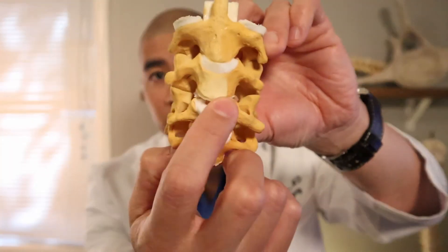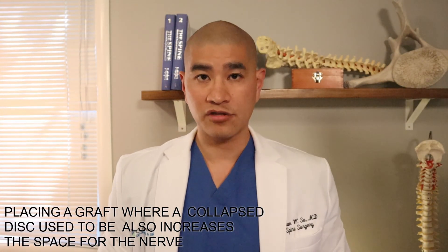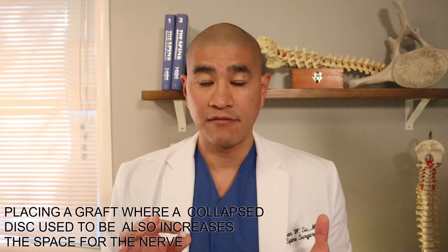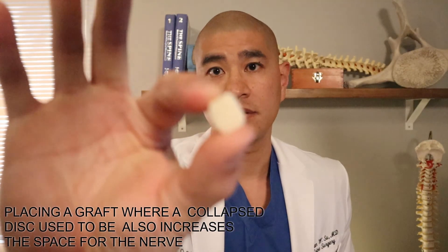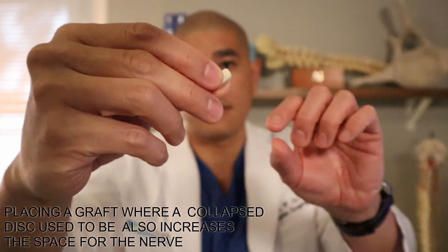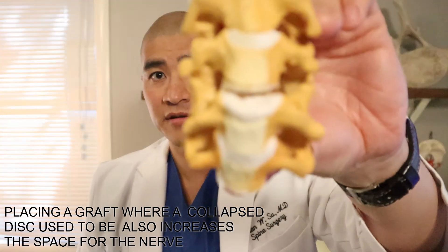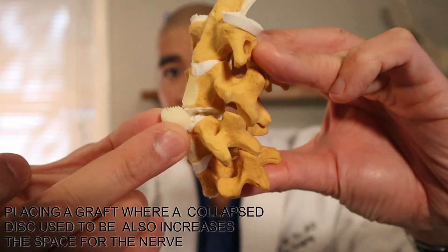After taking the disc completely out, we have to put something in its place, and there are two different options. One is structural allograft — basically donated cadaveric bone that has been irradiated so it doesn't carry disease. It's very small and about the size of a disc. We take this implant and insert it into where the disc used to be.